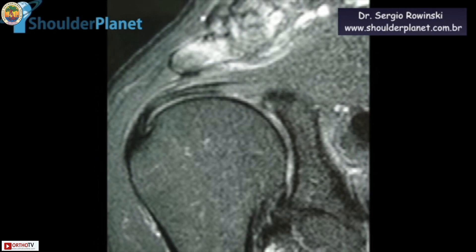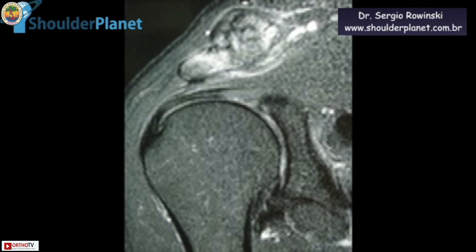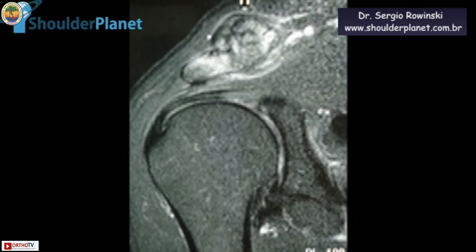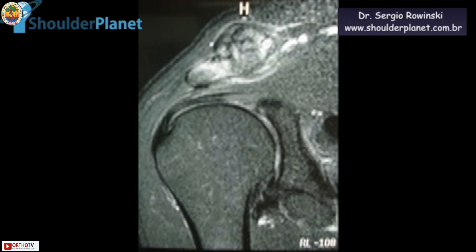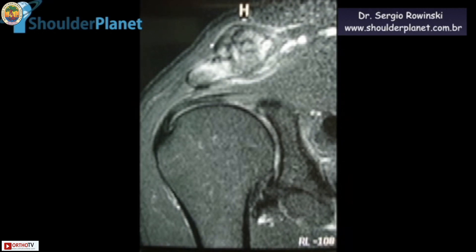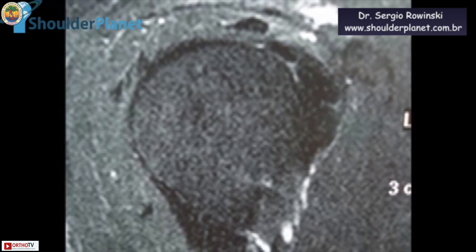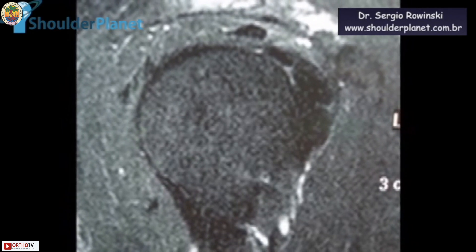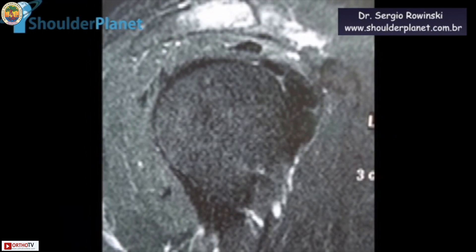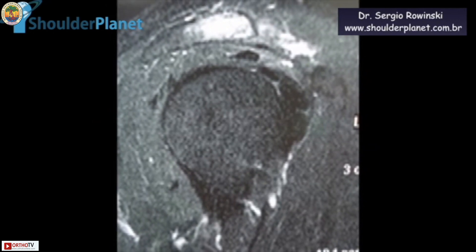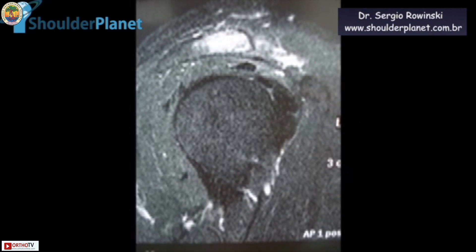We are seeing a coronal view of his MRI. This is a T2 fat-sat image in which we can clearly see a lot of edema and some degenerative cysts in the AC joint. His tendon was quite looking good, not only on physical examination but especially on the MRI scan. This is another T2 fat-sat image in the scapular plane showing the tendon in very nice shape, with some edema in the very tip of the acromion, which appeared to be a type 2 to maybe type 3 acromion.